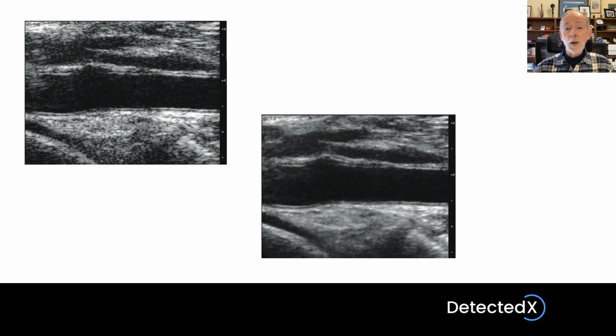And this is probably a combination of 2 things. First, the beams are coming from many different directions, not just at perpendicular incidence. So we have a beam width effect causing some blurring and thickening. But secondly, when you stop to think for a moment, you realize that the machine has to acquire 9 successive images and then average those together. Naturally, if there's any movement, then there will be blurring. So I think that's probably the primary reason that this image looks less crisp than the simple scan in the top left.